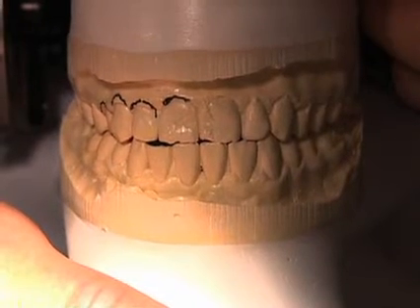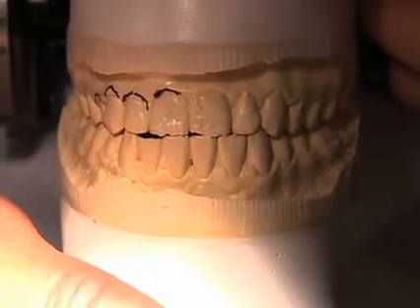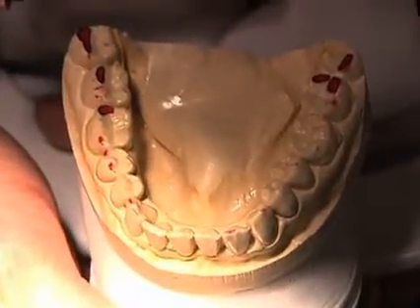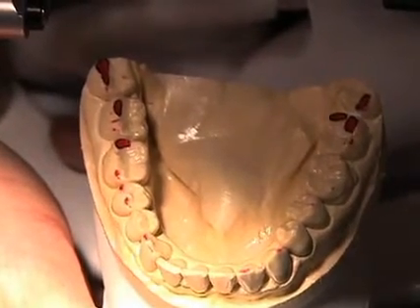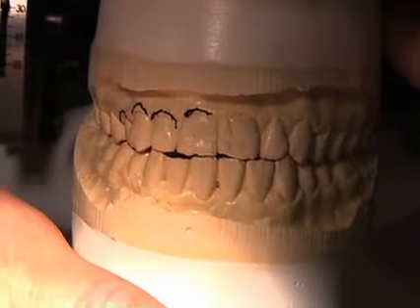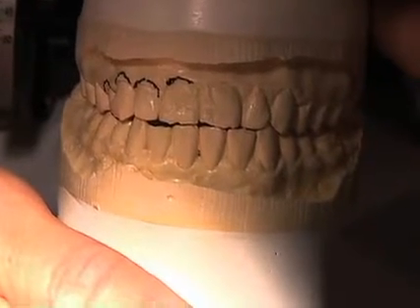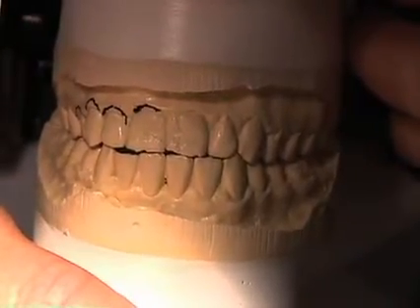During the treatment planning phase, it was determined that Tarina had some lateral interferences and some other occlusal issues that were resulting in the chipping that you see in her incisors. Lee identified those interferences on mounted casts. We then went back to Tarina's mouth and adjusted those such that she has occlusal harmony in the envelope of function. We also took the diagnostic wax-up and created templates for her to wear provisionally over her existing teeth, just long enough to confirm the correct final occlusal scheme.